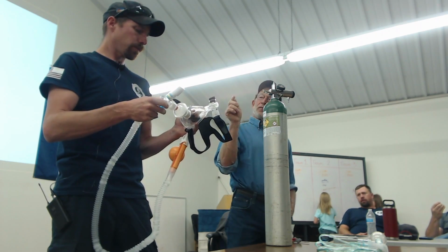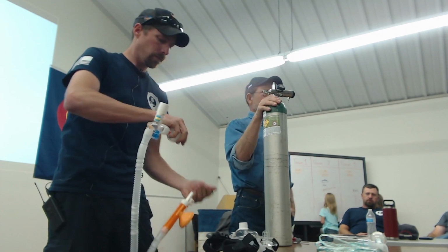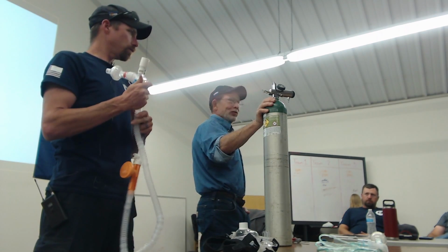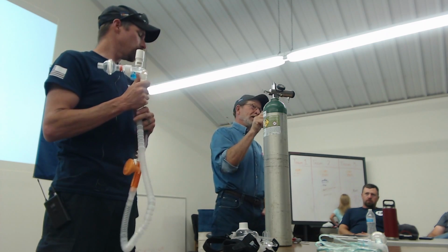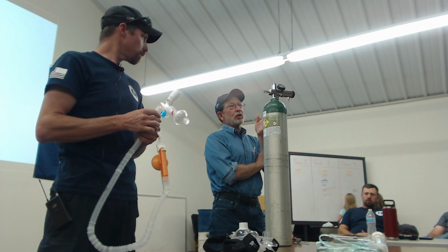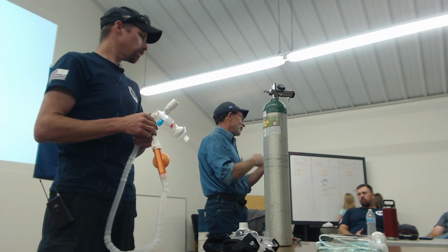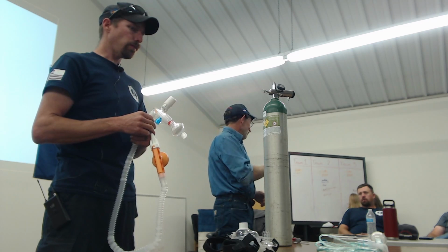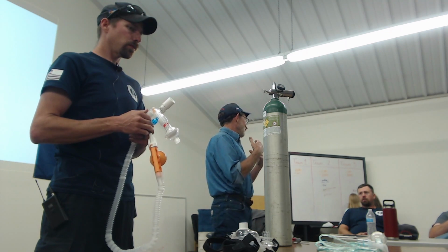So Tyler, you've mentioned a couple of times and called this a PEEP valve. And I want to see if you guys know what a PEEP valve is and what we're talking about when we mention a PEEP valve. So a PEEP valve is another acronym, and it's for positive end expiratory pressure, PEEP. And when we talk about that valve, since the pressure at the end of expiration is going to be the amount of pressure that we administer with this CPAP device throughout the entire respiratory cycle of inspiration and expiration, that's the amount of pressure that we're supporting ventilations with.